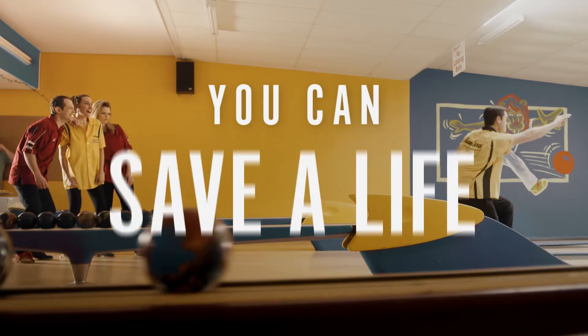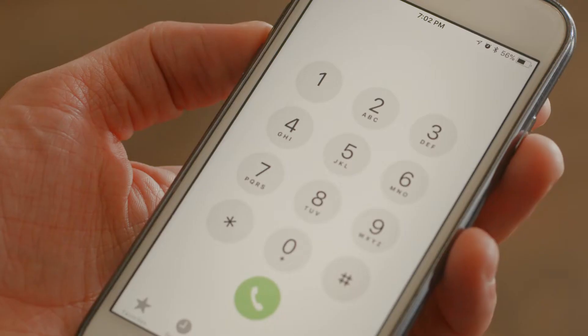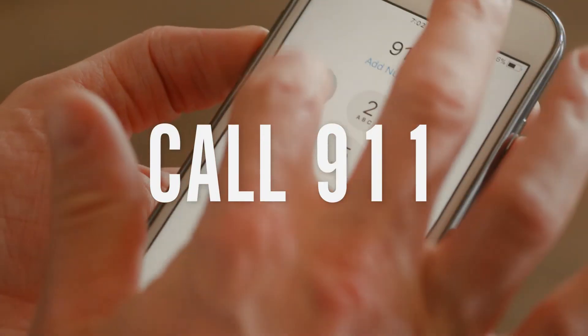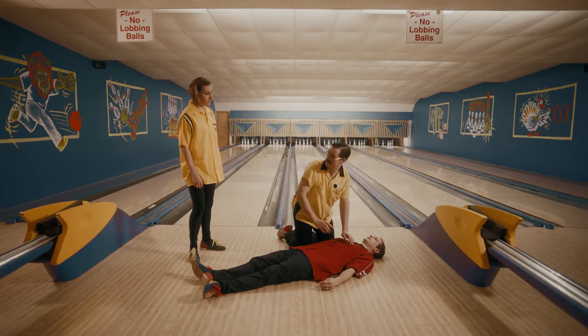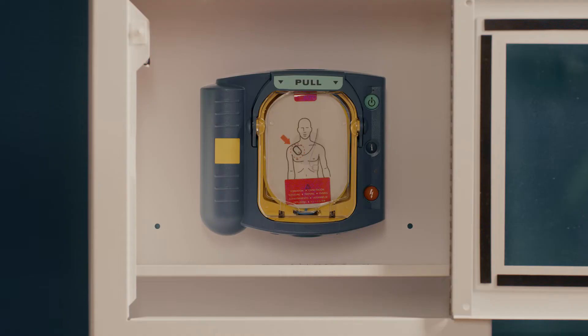If you can bowl, you can save a life with an AED. Here's how. First, call 911 and begin CPR. Next, send someone to obtain an AED, also known as a defibrillator.